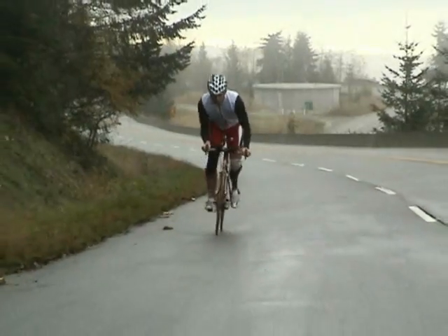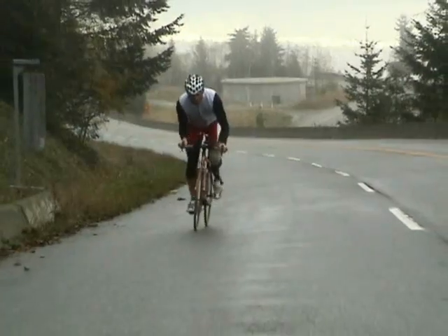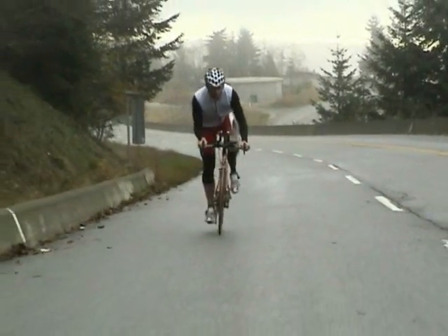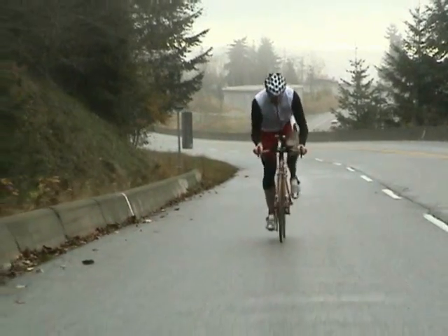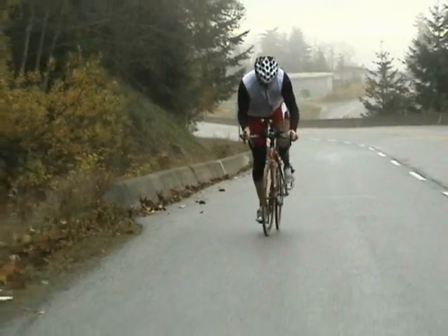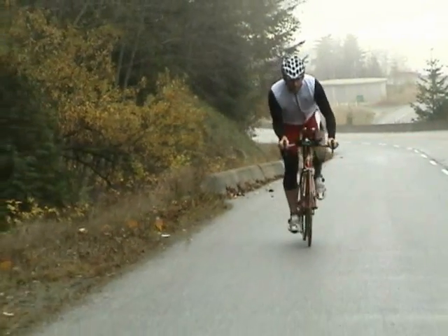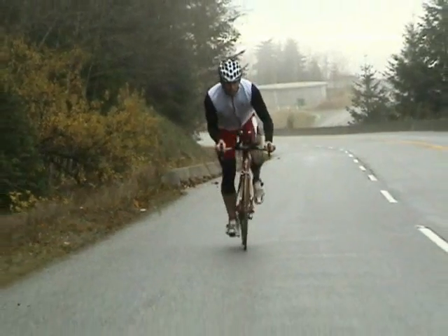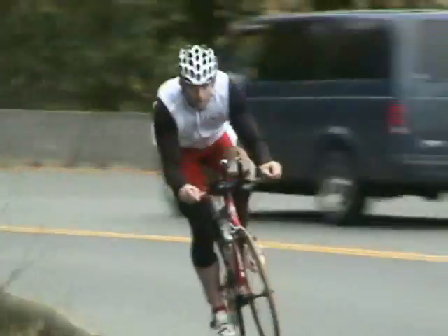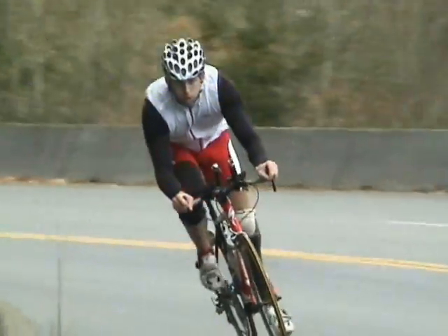So if I stand up out of the saddle, I feel a little bit of a bounce. Or if I'm climbing a hill and putting a lot of power through the pedals, I'll feel a little bit of flex there, and that's not ideal for cycling. If I had all the money in the world, I would buy one that was far stiffer and would not flex, so 100% of my power would go straight through to the pedals.